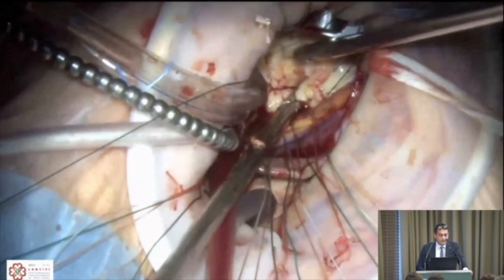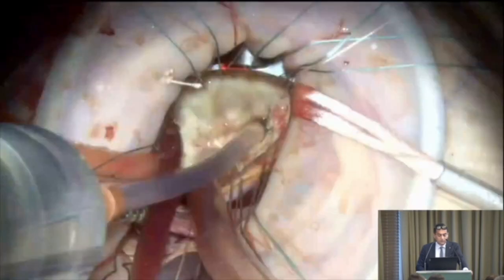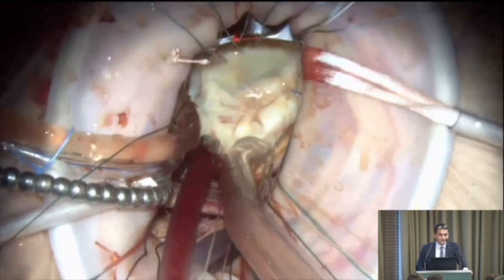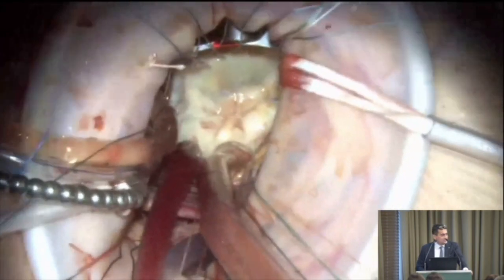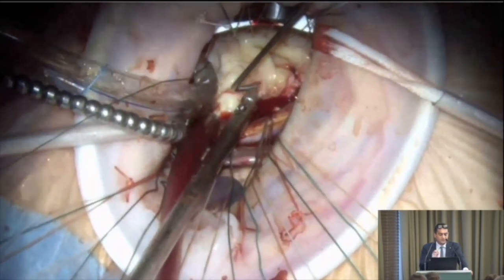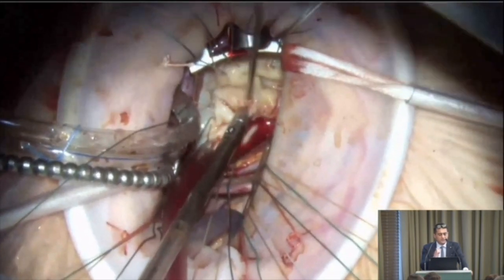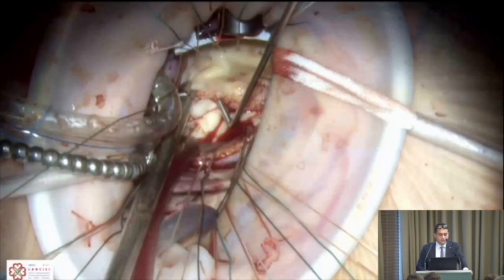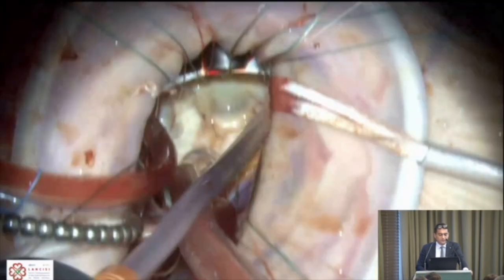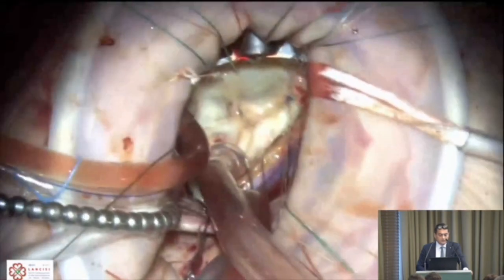Testing the valve again, it looks better, but we have a second jet to address at A2. There is a perforation, and the free margin grasped with forceps is very poor in quality. We decide to divide it and reconstruct it with a Prolene stitch. After checking again, the valve appears to be working nicely, so we proceed to ring implantation.